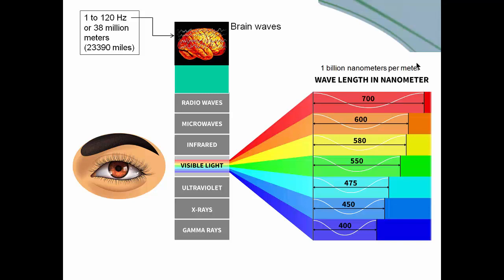As we move down, and when I say down, I mean we are decreasing frequency. That is the number of times per second that the wave goes up and down fully. That's frequency. It's called hertz. Hz is the abbreviation. Hertz otherwise means cycles per second, and in fact, that's what we used to say instead of hertz. We used to say cycles per second.